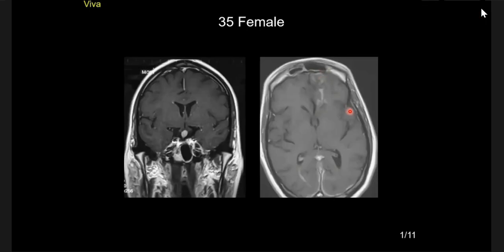Maybe sarcoidosis, maybe TB. Excellent. TB, sarcoidosis. You see, in your book, there is a differential diagnosis of infundibular lesions, and we have covered it, right? Infundibular lesions, and there are quite specific things which can happen to the infundibulum. We'll come back to this point.